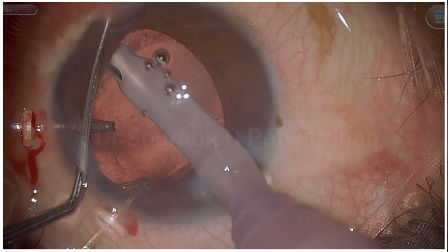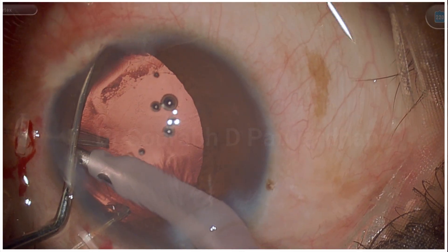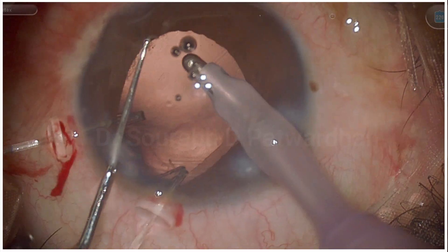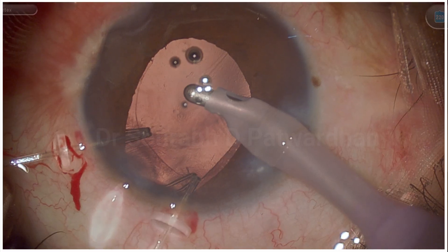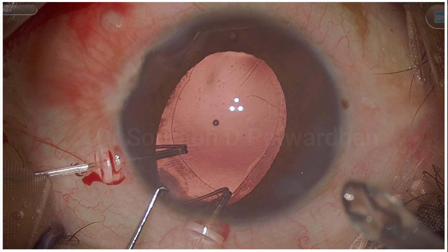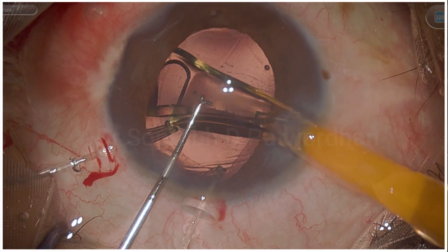It's okay if a little bit of cortex stays stuck — that's fine. You can try to remove it during the visco wash, and if it is a very small chunk, it will get absorbed in the post-operative period. We might have to use a little bit more steroids. That's why the initial visco dissection sometimes helps in reducing this kind of trapped cortex — try to do all-around visco dissection and then put the CTR. After OVD and BSS exchange, you can see the posterior capsule is quite firm and the bag appears okay with the CTR and the support of the capsular hooks.